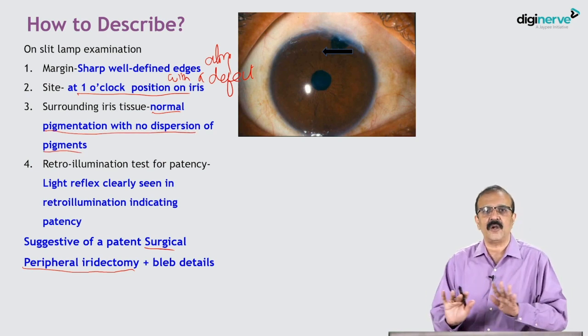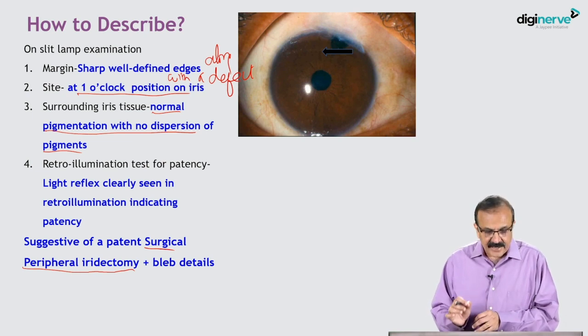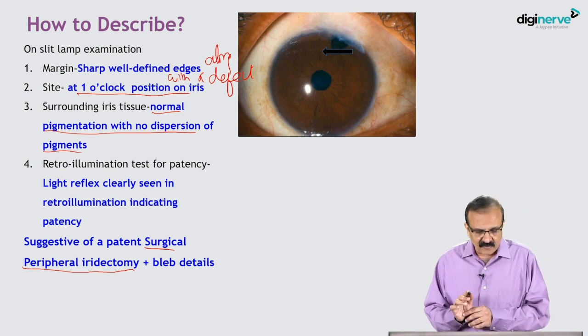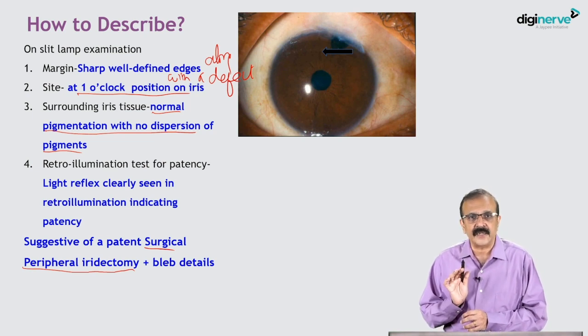We have not done a laser here. That's the point we are saying. Light reflex clearly seen in retroillumination indicating patency, suggestive of a patent surgical peripheral iridectomy.